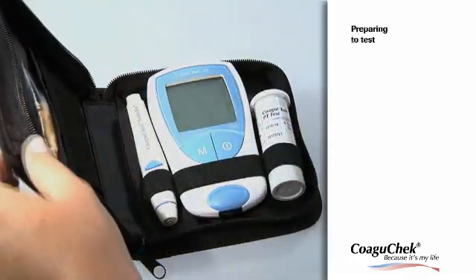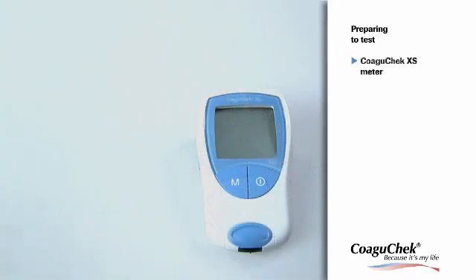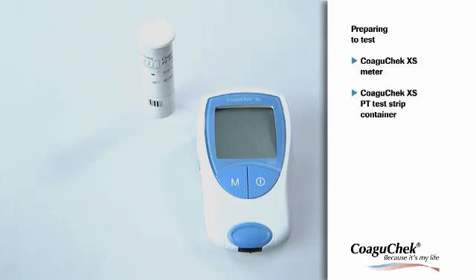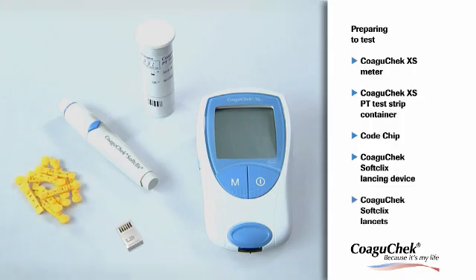Let's start with preparing the test. Please have the following items nearby: the CoaguCheck XS meter, the CoaguCheck XS PT test strip container, the code chip belonging to these test strips, the CoaguCheck SoftClicks lancing device, and the CoaguCheck SoftClicks lancets.